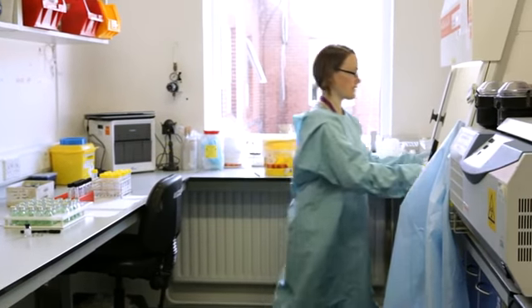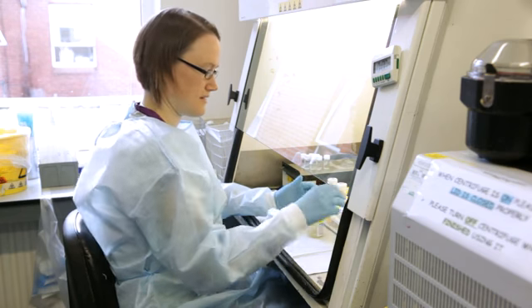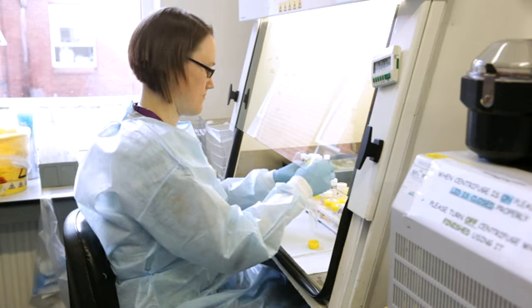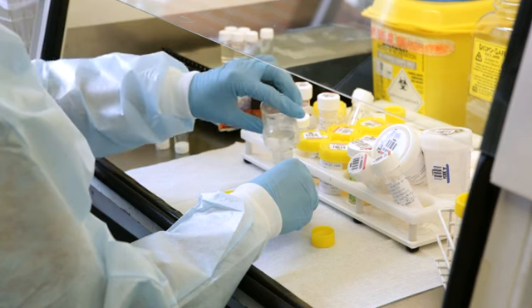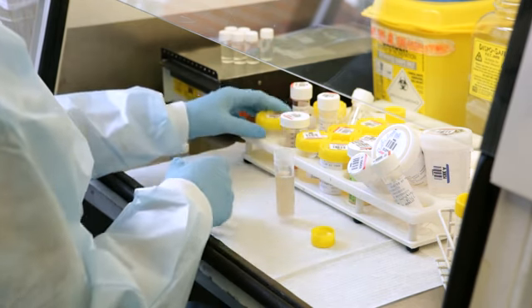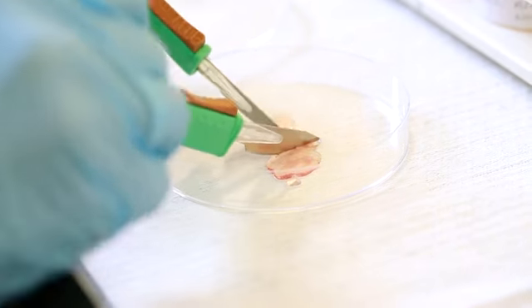Once evaluated and labelled, all specimens are transferred into new sterile universal containers, where respiratory samples are liquefied, tissues are cut up very small using scalpels and glass beads. All specimens are then spun at a very high speed in the centrifuge for 15 minutes in order to concentrate down the specimen and any mycobacteria present in the specimen. This part of the process takes approximately 1 hour.